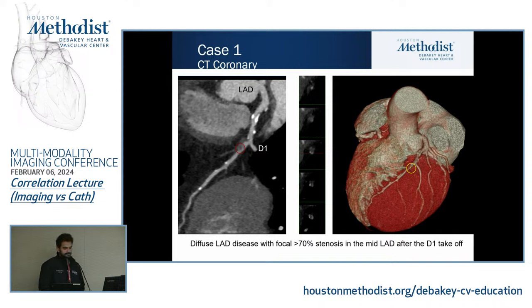I think in this situation it's kind of hard, to be honest, because even if you correlate it with anatomy and physiology, unless you actually know, if you increase flow through the proximal lesion, you don't know if the flow in the distal lesion is going to get better or worse. The right answer is probably that you'd have to fix it and do a real-time FFR at that distal lesion to see if the FFR actually changes, but I'm curious to hear what Dr. Alma or anyone else thinks.